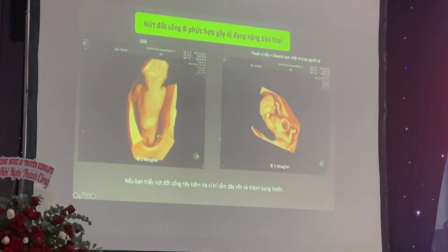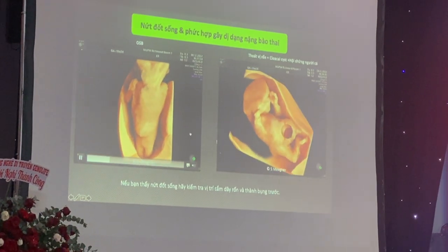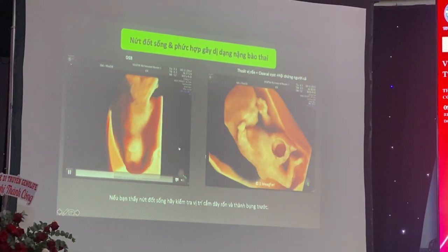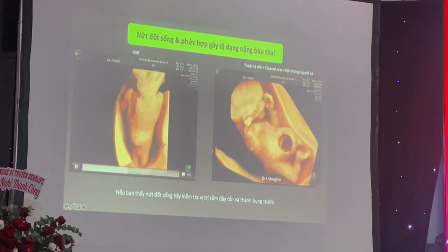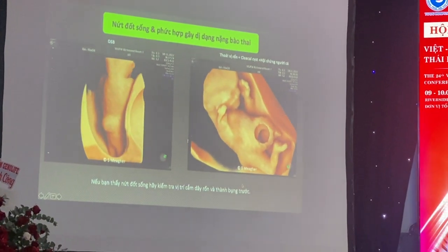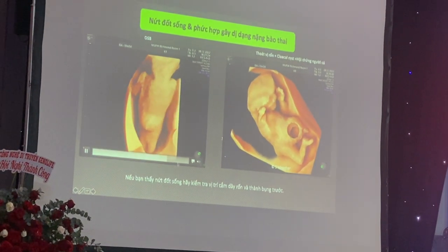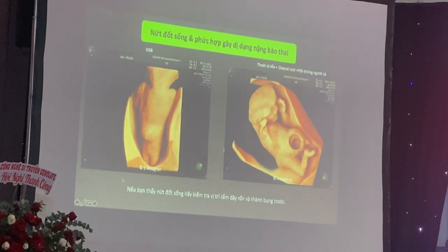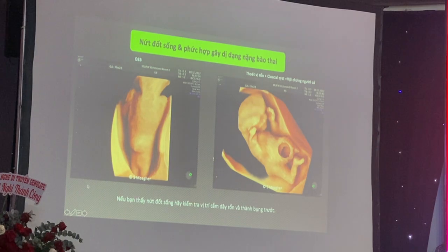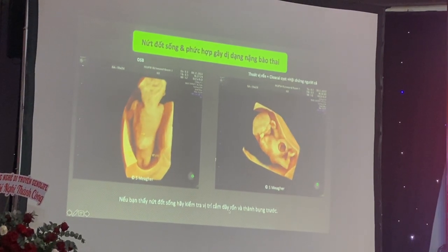Yeah, thank you. As each page we go, just play both clips. Thank you. This is a fetus with a major spinal abnormality with sacral agenesis, and in this case a major anterior abdominal wall defect with a very abnormal deformity of the limbs. So when you're looking at something like this, you're considering the OEIS complex, and you also consider the possibility of amniotic band syndrome. In the first trimester, you will have a much higher detection rate of amniotic band syndrome when compared to the second trimester.